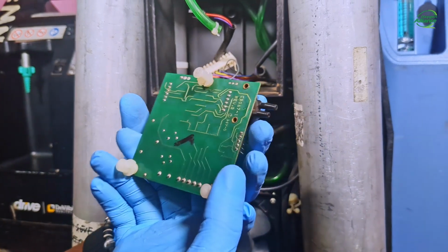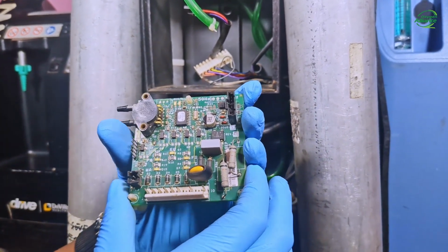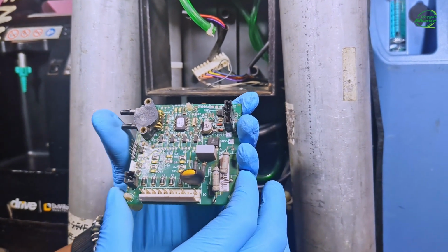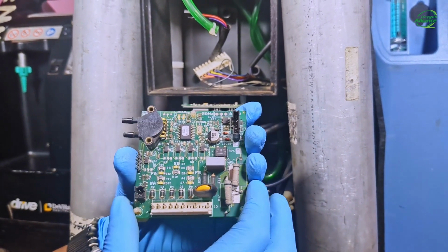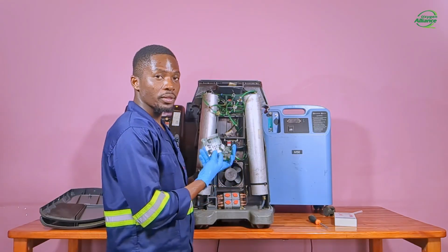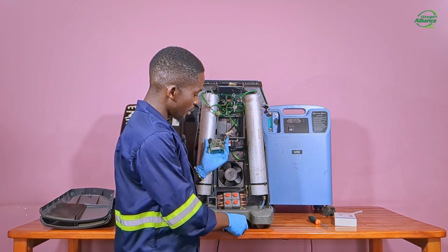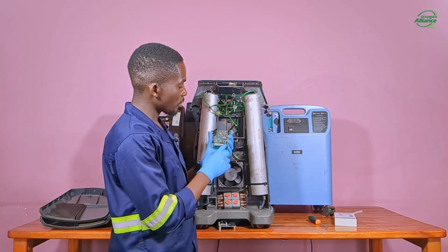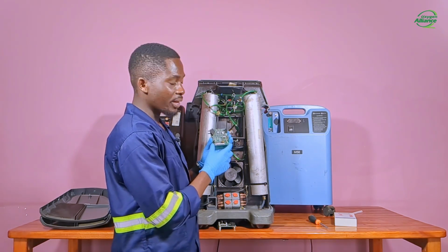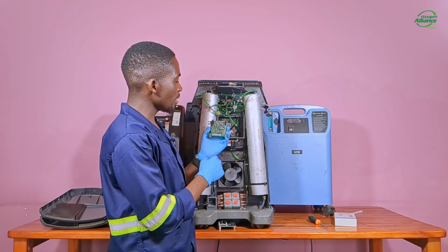So I will replace this board with another working board from another oxygen concentrator and see how the concentrator will function. So this is a working control board, and mind you, there are also other components that usually get damaged on this board, but these are to do with power supply.